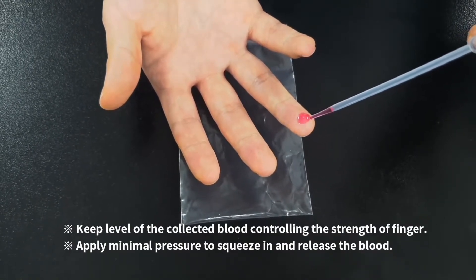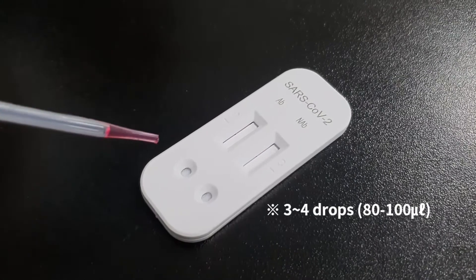Collect blood sample using pipettes and add 3 to 4 drops of blood into the two wells each.